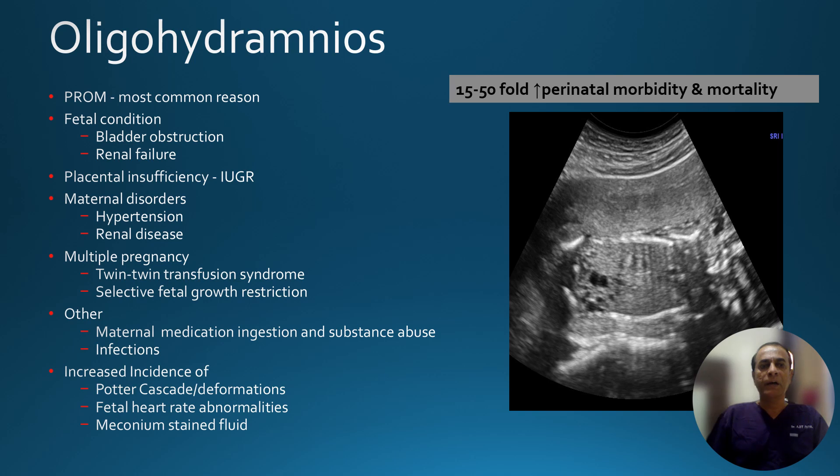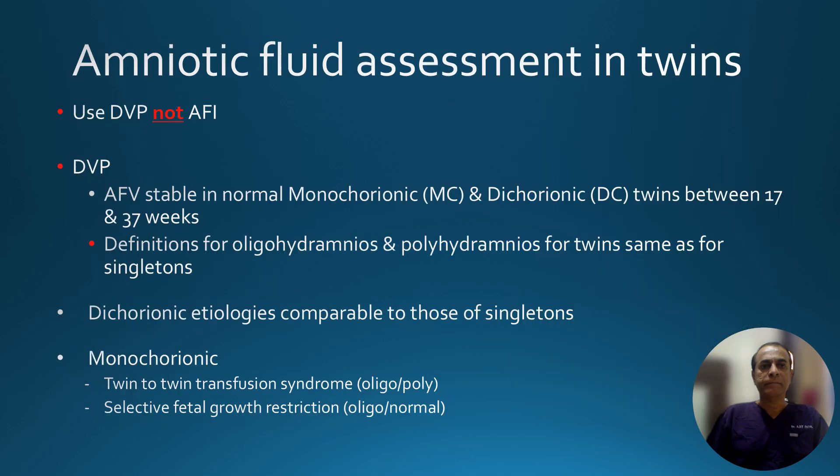Though the four-quadrant AFI technique is good for single-ton assessment, for twins it is not possible to divide each twin's sac into four different quadrants. So here we stick to the deepest vertical pocket and measure it in the same manner. If the deepest vertical pocket is between 2 to 8 centimeters it is normal; less than 2 is oligohydramnios and more than 8 is polyhydramnios.